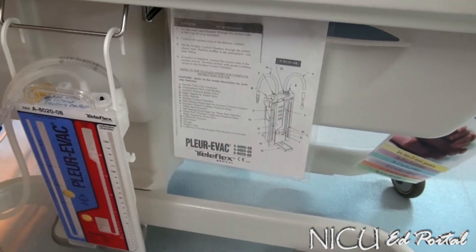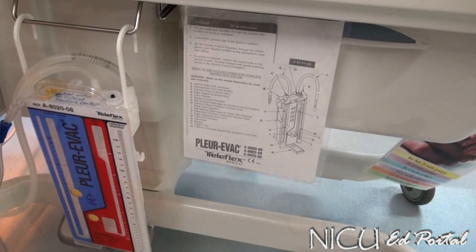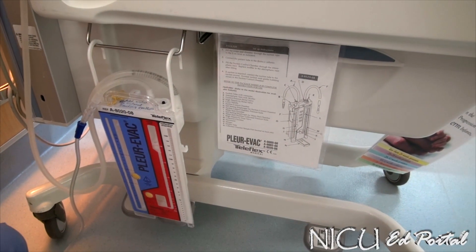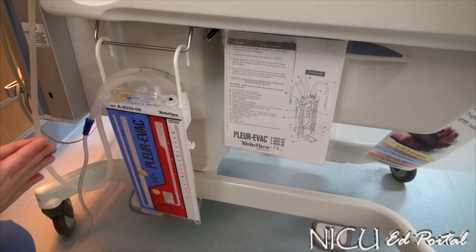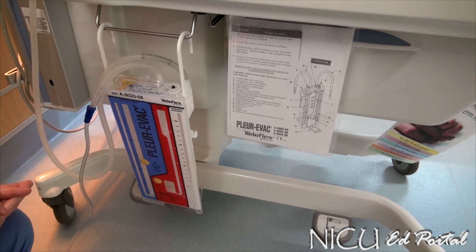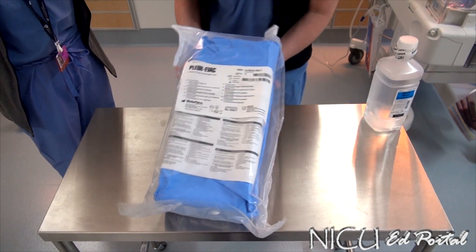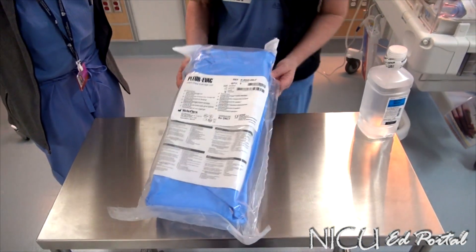With the unit, there's an insert that also tells you what each part is, and that is within the unit package when you open it. For today's purposes, we'd like to clarify what chamber does what and what the parts to the system are. That's what it looks like set up, and next we'll walk through actually setting up the package.